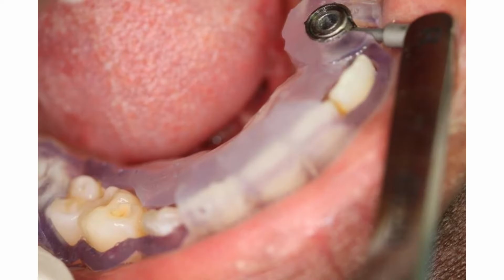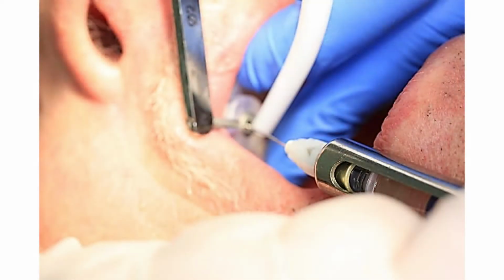Because again, if you have to abandon the procedure and you've anaesthetized the patient, then that's unnecessarily put the patient to inconvenience. You can, if you wish, in certain situations, actually inject solution through the guide and use the guide to help you anaesthetize the patient. And sometimes you might find that just local anaesthetic in the region is all that's needed.